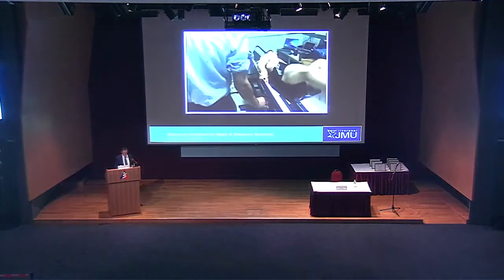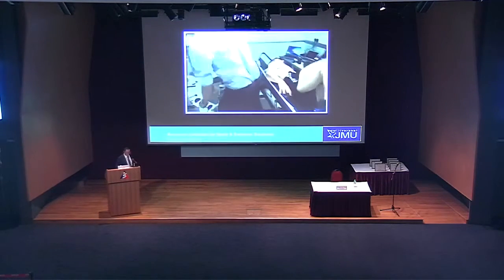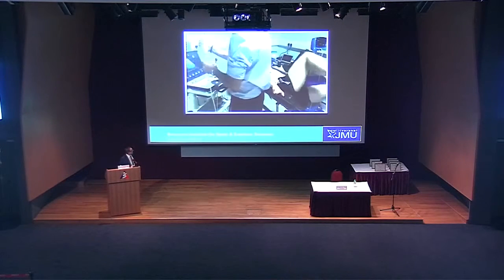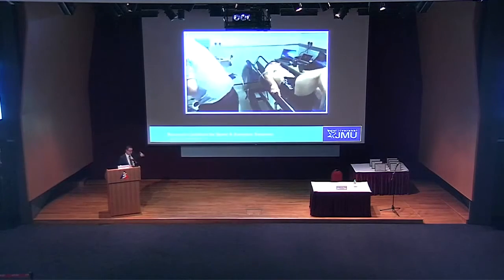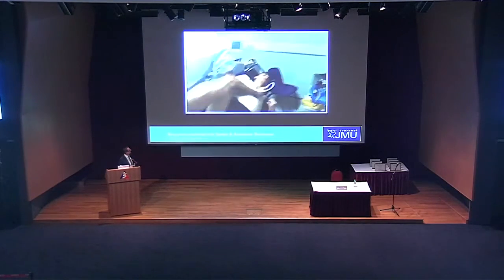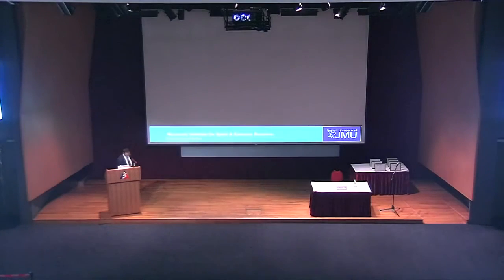So what we did, and this isn't the athlete for anonymity reasons, we put them on a couch and we exercise them. We get them working hard. This couch slopes to the side, so it allows us to get the echo pictures. And you can see we can still get images even though he's... Oh, no, you can't. You can believe me, they were the best pictures.